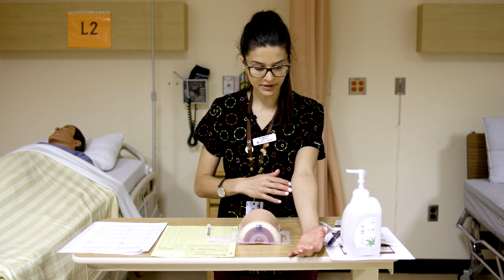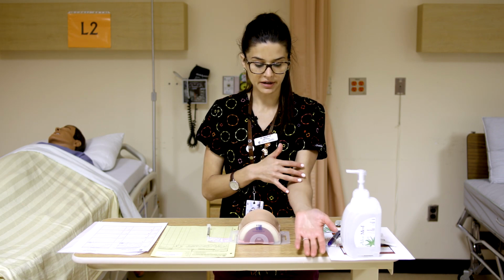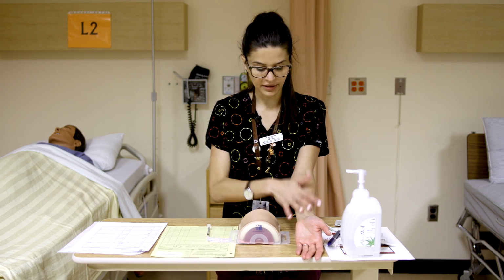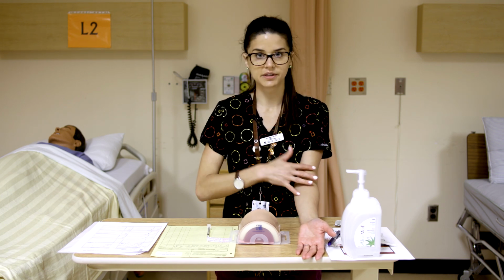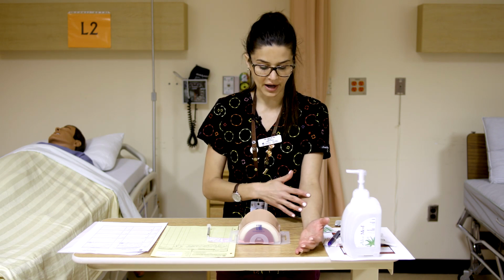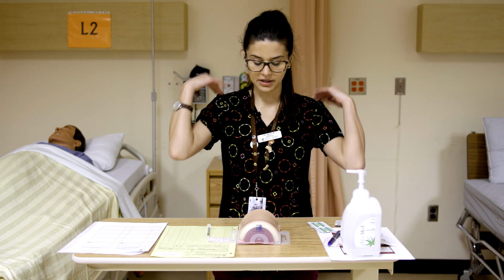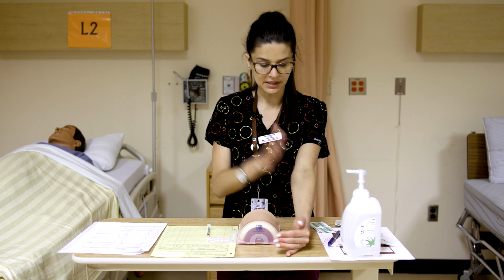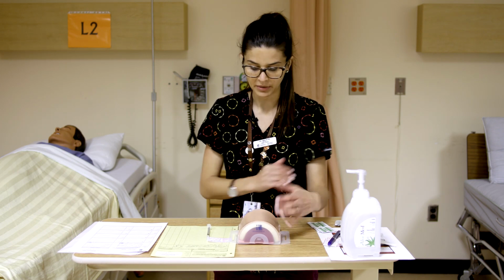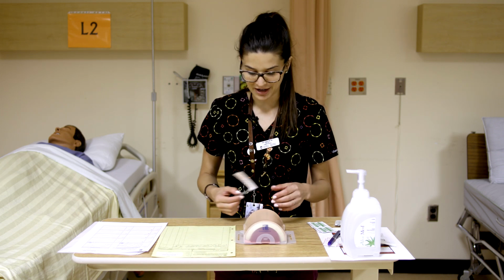So a good site, or the most typical site for intradermal injection, is actually on the underside of the forearm. And it's a good site because it's sort of a clearer, thinner skin. There's not usually a lot of lesions or hair in this area, so those are things you'd want to look for and avoid. Other places where you will see intradermals done is on the back, sort of near the scapula, but I would say most common, by and large, is that underside of the forearm. So that's what we're going to pretend this site is on our patient.